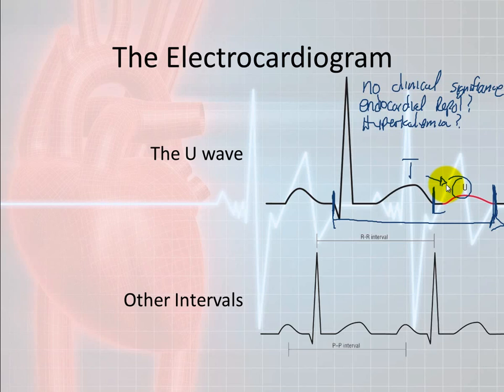therefore it's probably normal. Now, a couple other intervals I want to talk about are the R to R interval and the P to P interval.